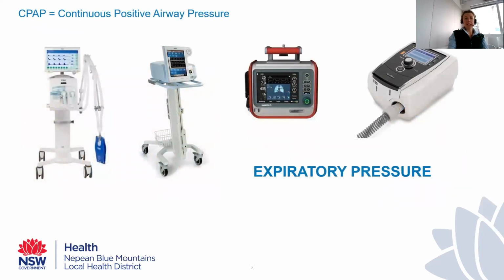CPAP stands for continuous positive airway pressure. Now, this is a therapy that can be delivered via a range of different machines and equipment. And I've got some images here of the machines that we use across the Nepean campus. You might have ones that are similar in your facility, or you might have ones that are a little bit different. And they range from quite fancy machines there on the left, right through to machines that are more basic here on the right.